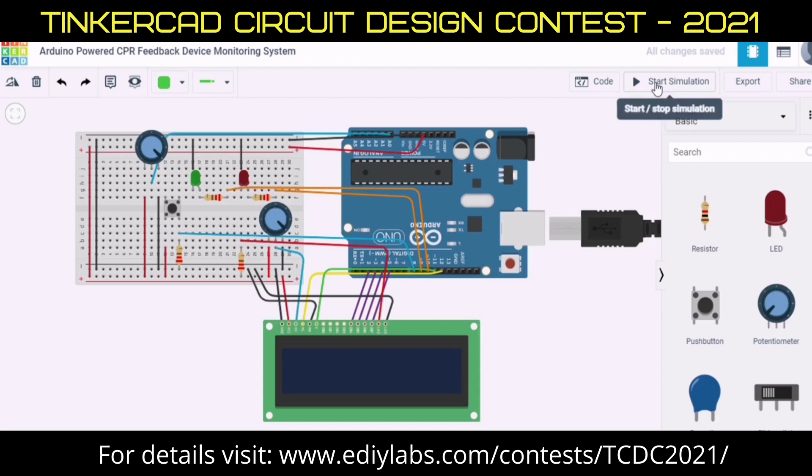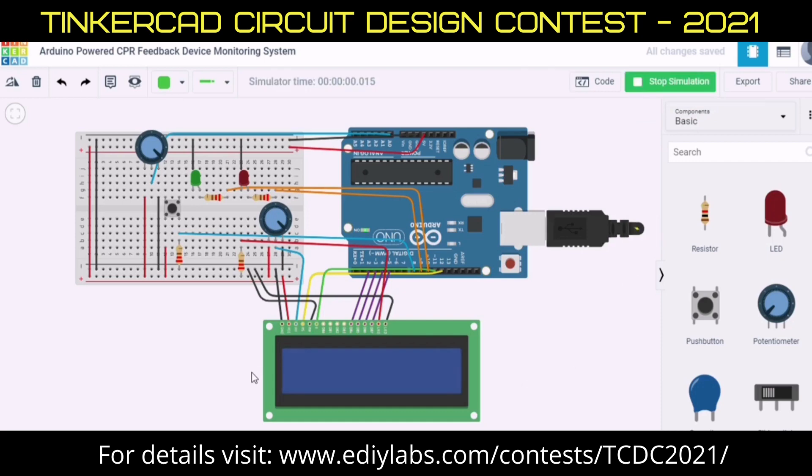If I click the start simulation button, you can see here the LED will show 'Start CPR process' and the green light will glow.